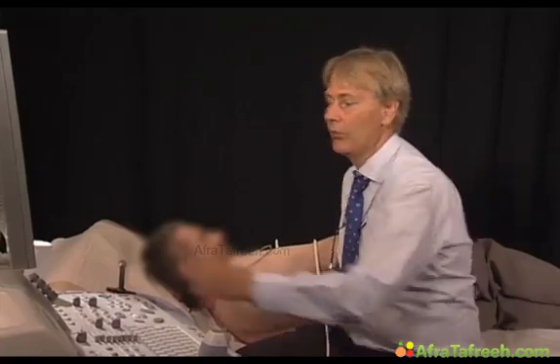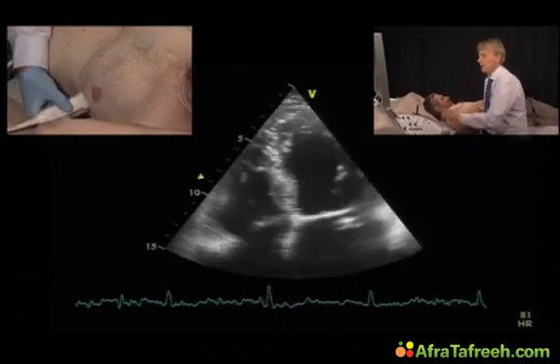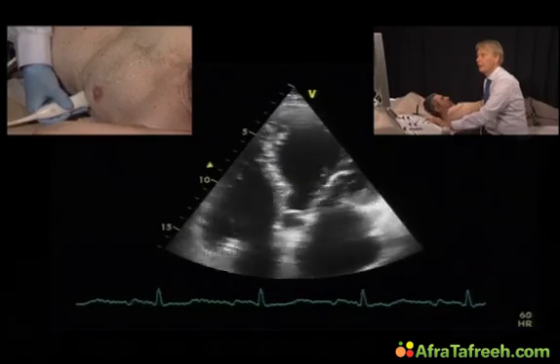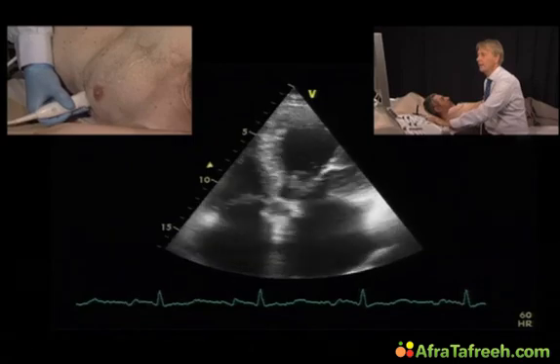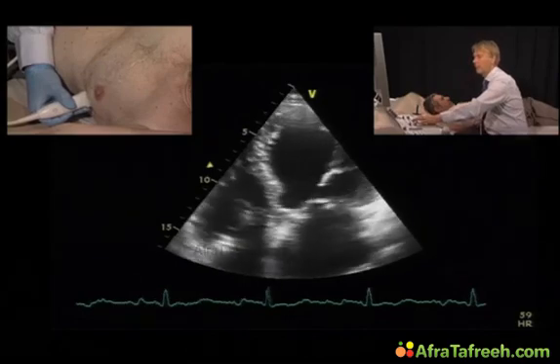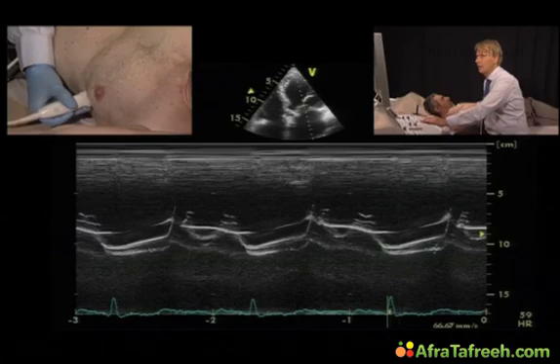So the parasternal approach in this patient did not help us very much, so we'll turn to the apical view. Again, we see the prolapse, but what we see immediately is that there are very small portions of the valve which are parallel to the anterior leaflet, behind the anterior leaflet in the left atrium, and which show a very fine fluctuating motion caused by the regurgitant jet. We can even put an M mode inside here, and we can display the flail portion of the posterior leaflet.